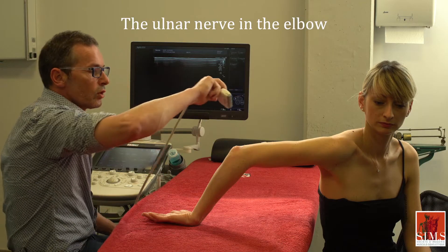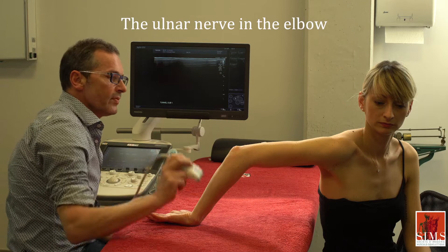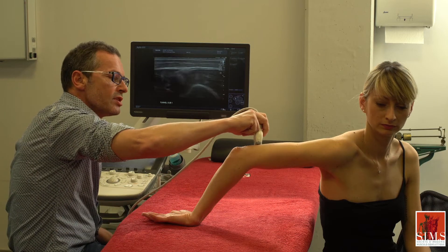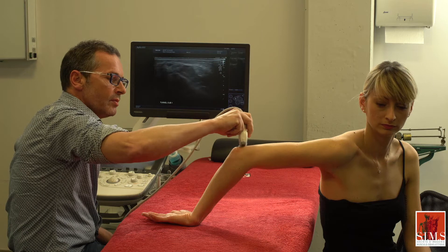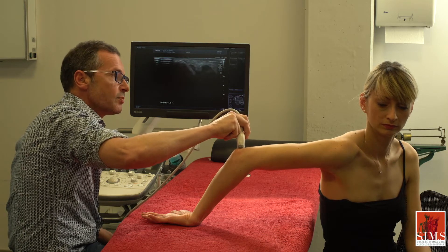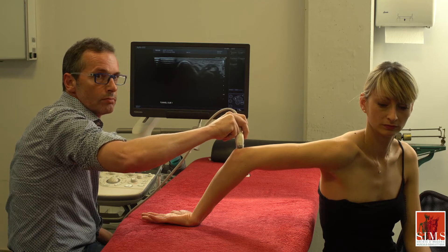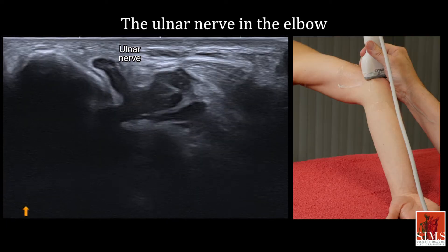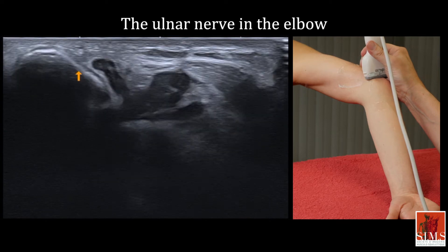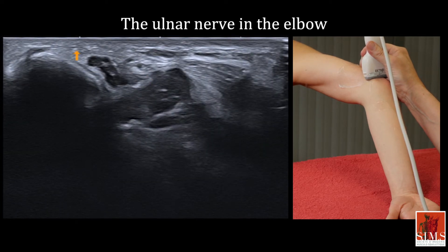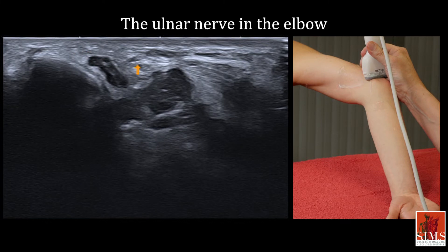Because the ulnar nerve is on the posteromedial aspect of the elbow, we need to place the arm differently to study it properly. So we place the hand on a hard surface to get an axial, posteromedial view of the elbow. In the elbow, the ulnar nerve runs posteromedially in an osteofibrous tunnel covered by a retinaculum, the cubital tunnel.